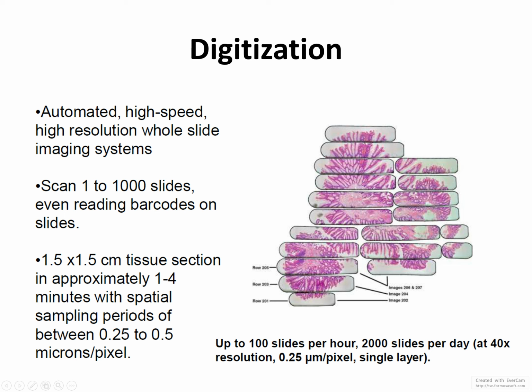So even for one slide, it will probably take lots of time to finish scanning. So the whole slide scanning machines actually need to be very fast.